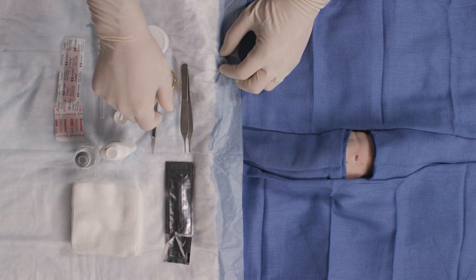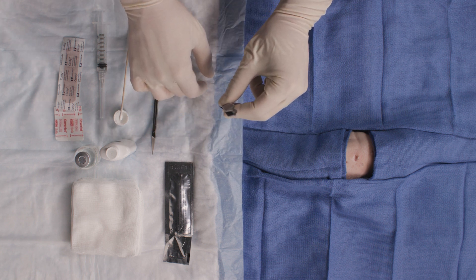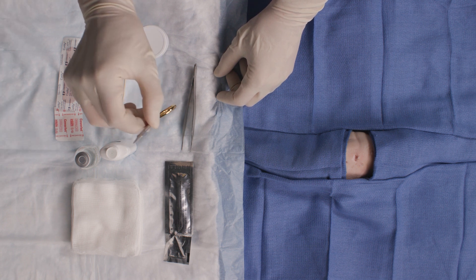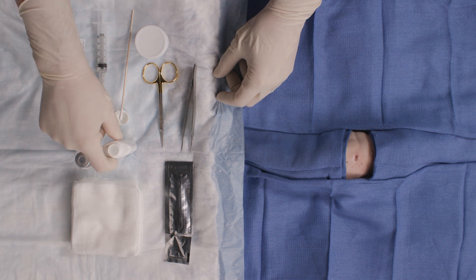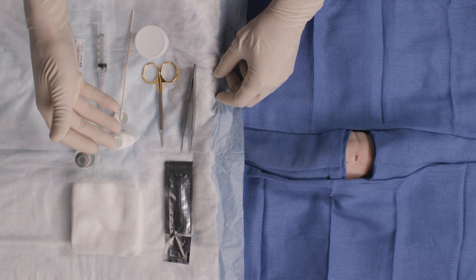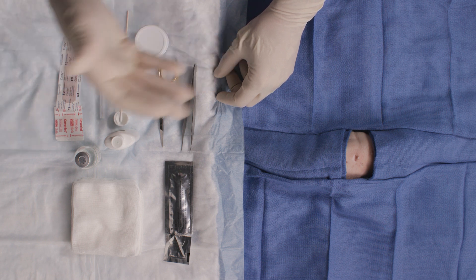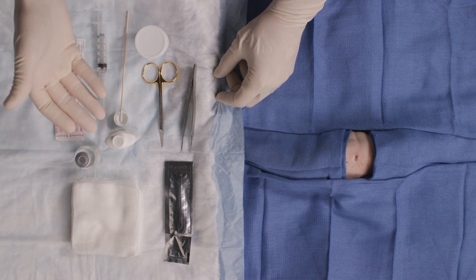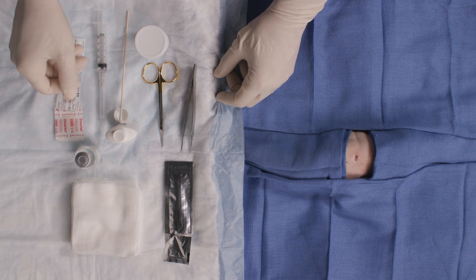You also want to have a few different instruments. You want to have some pickups — forceps to grasp the skin tag. You want to have some iris scissors or sharp scissors to snip the skin tag. You want to have a cautery agent for after. My go-to is aluminum chloride, or Drysol. This is a clear solution, applied with a simple cotton tip applicator, and is really good for hemostasis and cauterization. Other options include Monsel's, silver nitrate, or electrocautery, but those can cause permanent staining.